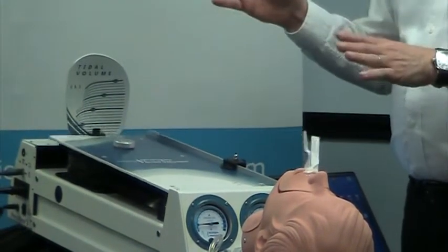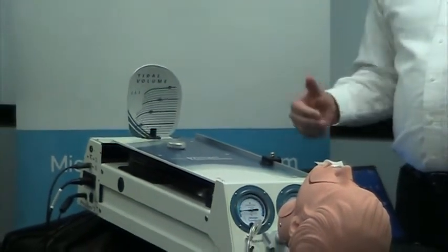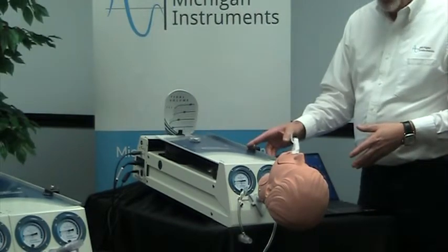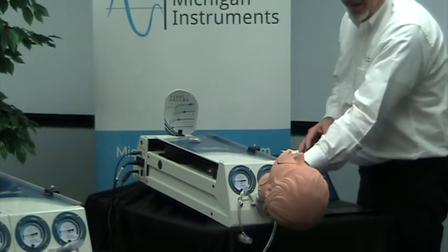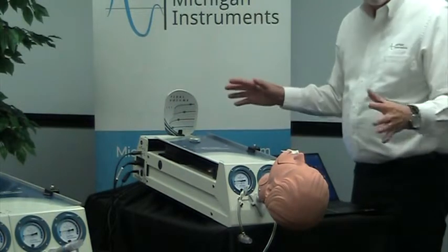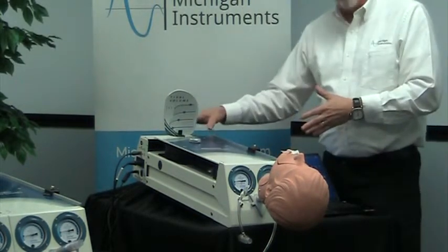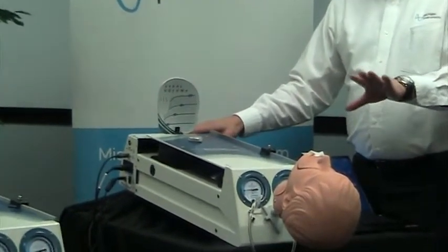The test lung works in exactly the same way as our traditional, well-known, well-respected TTL and NuView systems. They still have a variable compliance, you still have pressure gauges for airway and lung, connections for optional resistances that you can apply, and it really works in exactly the same way — the same physical and performance capabilities. In fact, if you turn off the SBL, the unit can be used as our traditional units have been used.